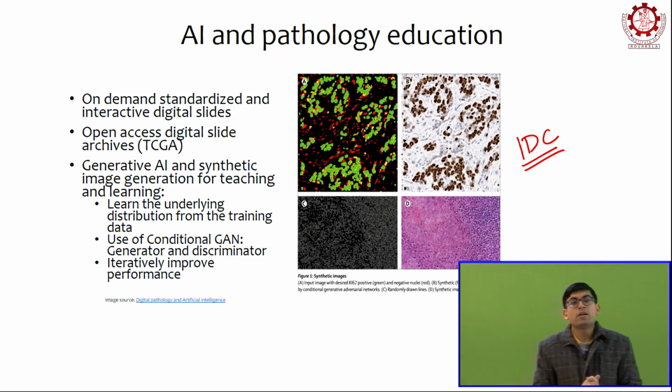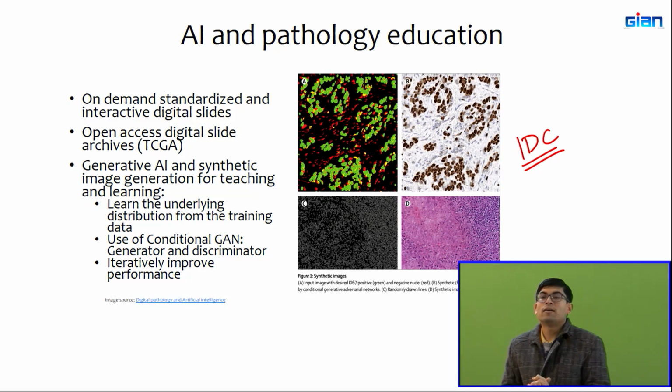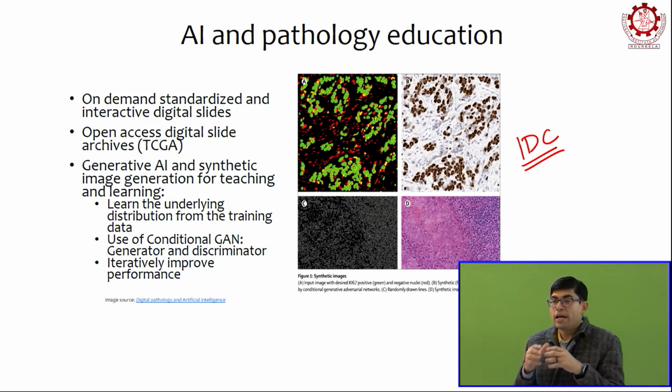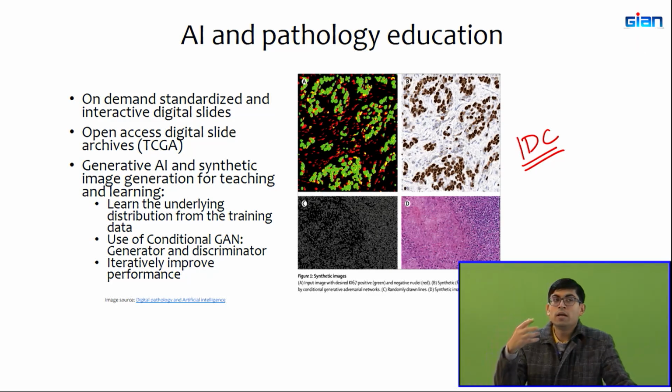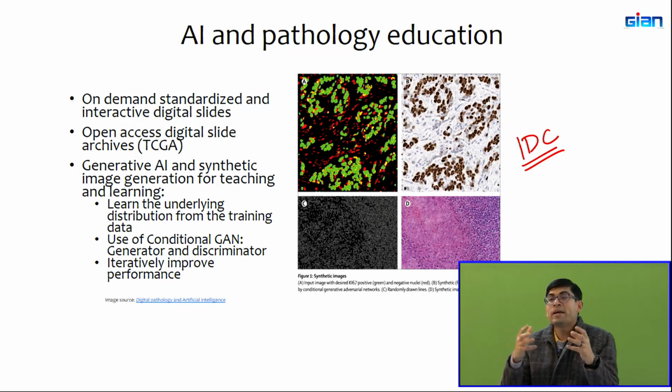And also with generative AI, there's another fascinating aspect to it. So let's say, and this is a very hypothetical scenario, that for a certain disease the structure of the cells appears a certain way, the layout of the cells appears a certain way, the cells appear at a particular position. What you can do is extract the cells, segment the cells, and then train an AI model to give you similar images, or images with similar cell layouts, but something else that's different, right? So you can essentially extrapolate your images to make them look like something else.